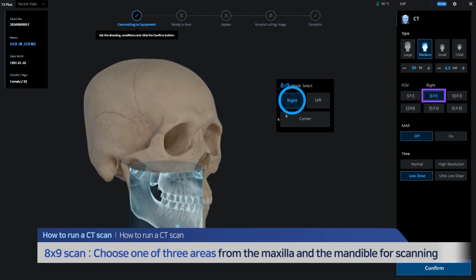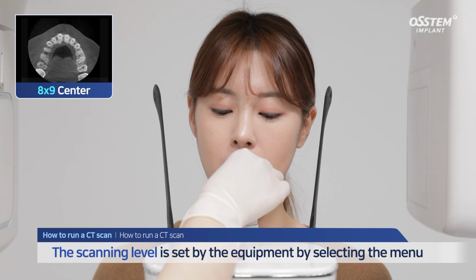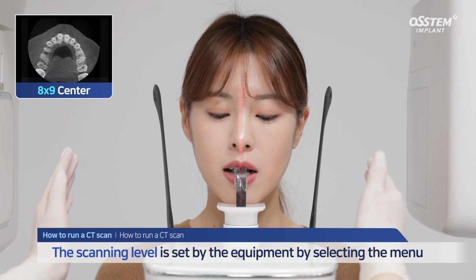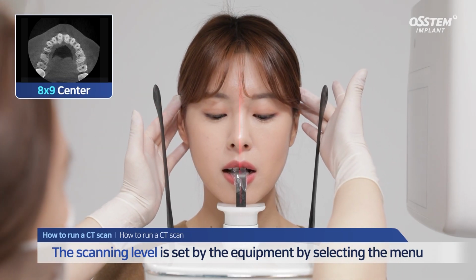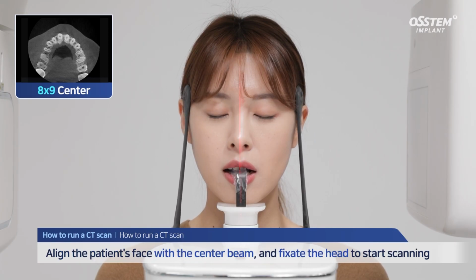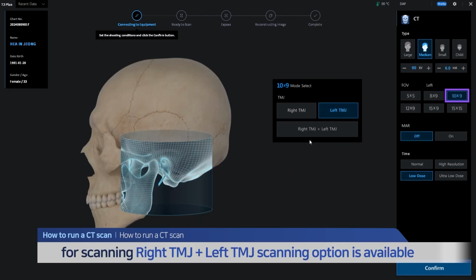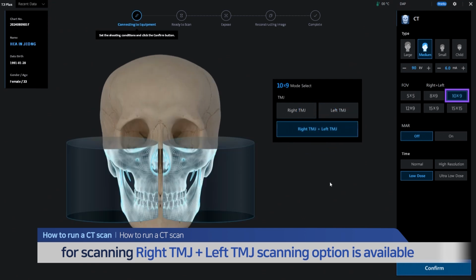For an 8 by 9 scan, you can choose one of 3 areas from the maxillary and the mandible for scanning. For 8 by 9, the scanning level is set by the equipment by default at the time of selecting the menu. Align the patient's face with the center beam, then fixate the head to start scanning. 10 by 9 scan is used for TMJ scan only. You can select either right TMJ or left TMJ for scanning, or scan both TMJs at once.